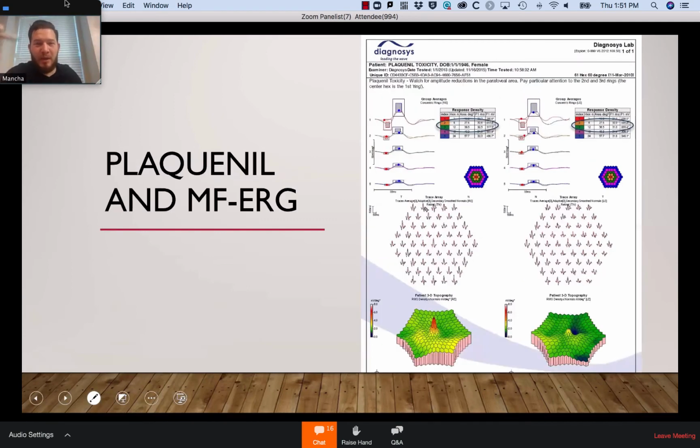And again, I didn't really have a lot of time with this lecture to go through extra types of testing. We already know that with Plaquenil, we always get a baseline, right? Visual field 10-2, we get the fundus autofluorescence, we get multifocal ERG, and all that good stuff.